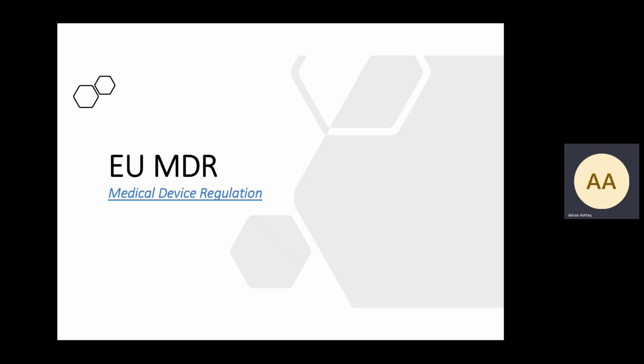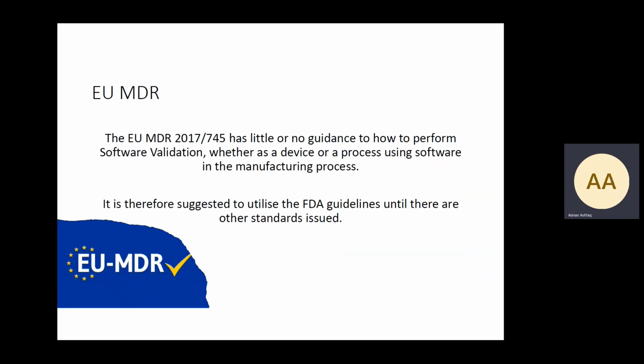Now moving over to the EU MDR, just to give you some pointers towards medical device software. The EU MDR 2017/745 itself has little or no guidance on how to perform software validation. As I mentioned, the MDCG guidance documents are very useful.